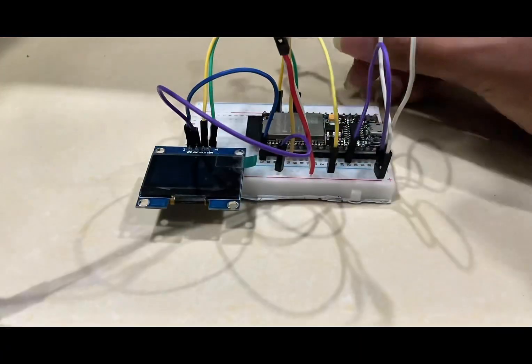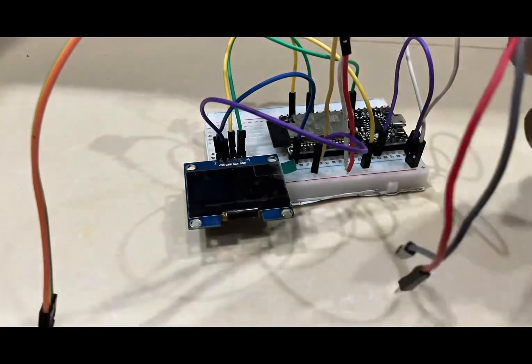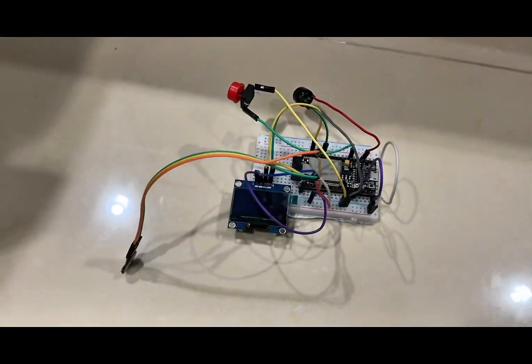Next, we will connect the button. So the button's one leg will go to ground, and the button signal pin will go to pin 4. Last one is the buzzer. We will connect the buzzer's one leg to ground and one leg to the buzzer pin that we use, which is pin 15.